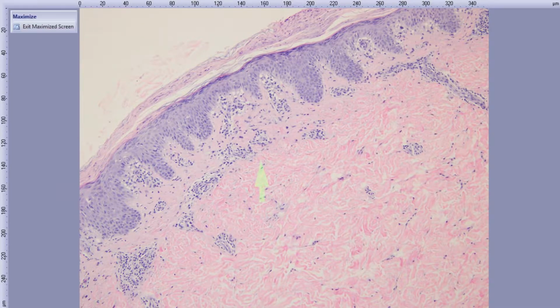If we wanted this to be, say, PLEVA, then I would magnify a lot of the things I just said, such as maybe more lymphocyte exocytosis, more obvious necrotic keratinocytes, because that correlates with the clinical ulceration of the lesions. And then I would like some more inflammation as well. So this fits more into a Pityriasis lichenoides chronica.